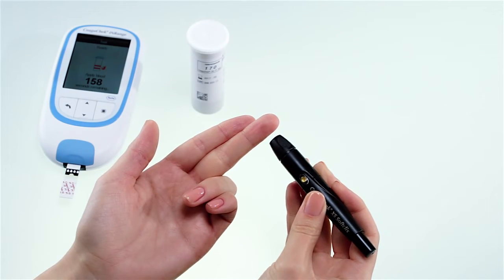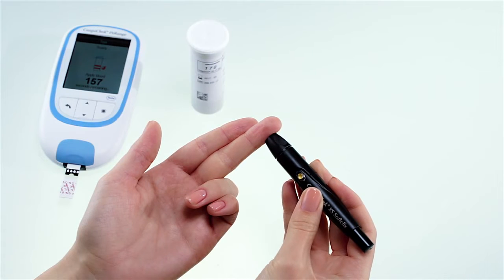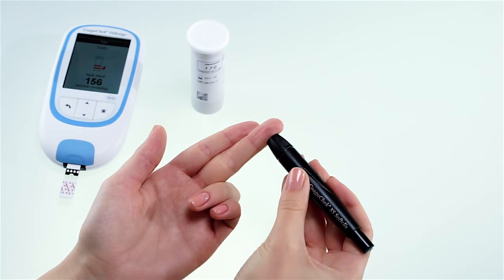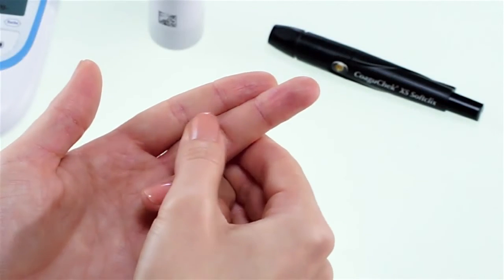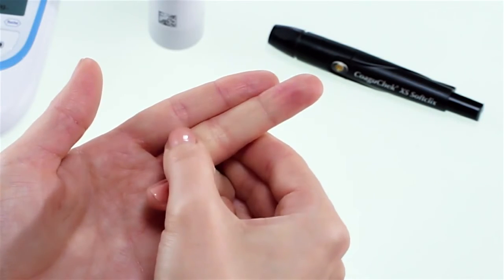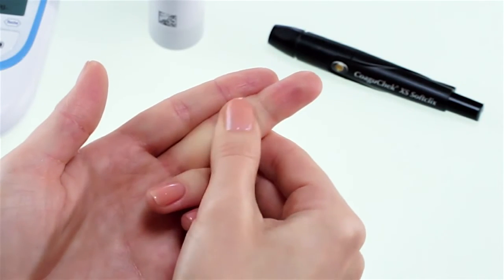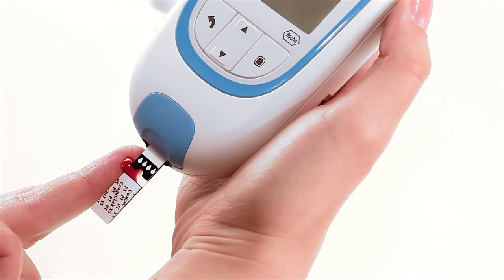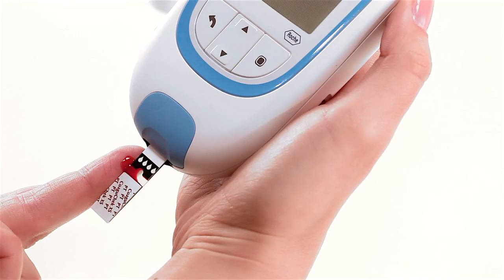When lancing your finger, always use the side of the finger rather than the tip, as it is more comfortable and less sensitive. Press the lancing device firmly against the side of your finger and press the yellow release button. Lightly massage the lanced finger toward the fingertip until a drop of blood is formed. Apply blood directly from the finger to the sample application area of the test strip and let it fill. You must apply the blood drop to the test strip within 15 seconds of lancing the fingertip, as applying blood after this time may cause an inaccurate result.